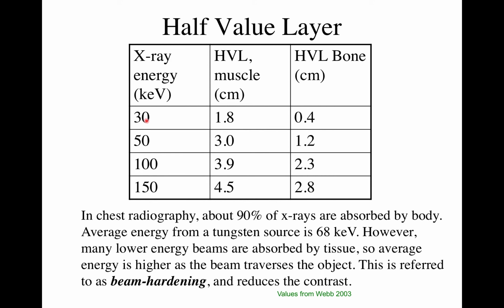So here it's going to be energy dependent again. For muscle, at 100 keV, and 50 to 100 keV is where we're operating in clinical imaging, you see it's 3 to 4 centimeters, and 50% of those photons will be gone. In bone, it's only 1 to 2 centimeters.